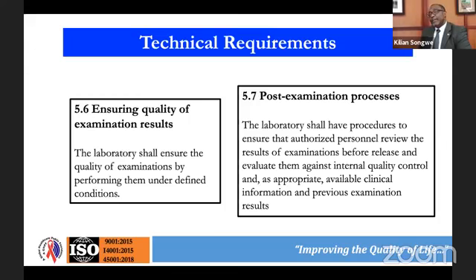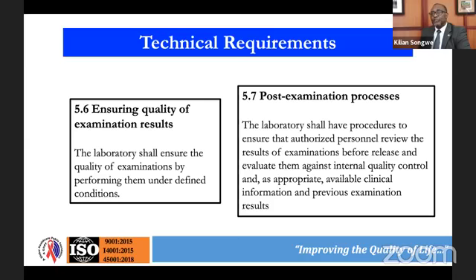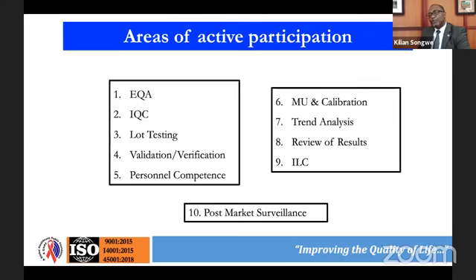And then finally, of course, we have the examination process, the post-examination process. In this process, we are basically asking, now that the examination has happened, are all the procedures used? Are they the best procedures? Do we have authorized personnel? Do we have people who have the competencies to be able to review these examination results before they actually go out? So these are areas of potential error in the laboratory that we want to visit.